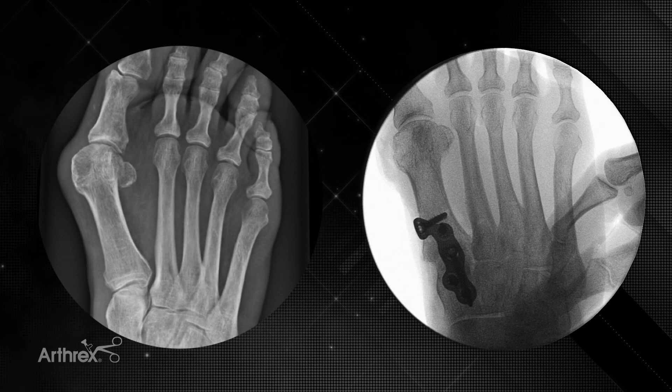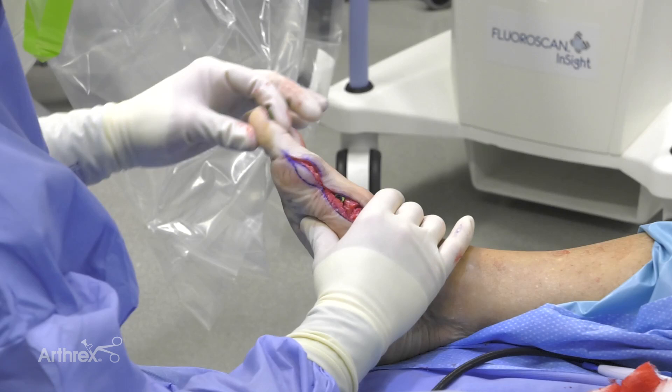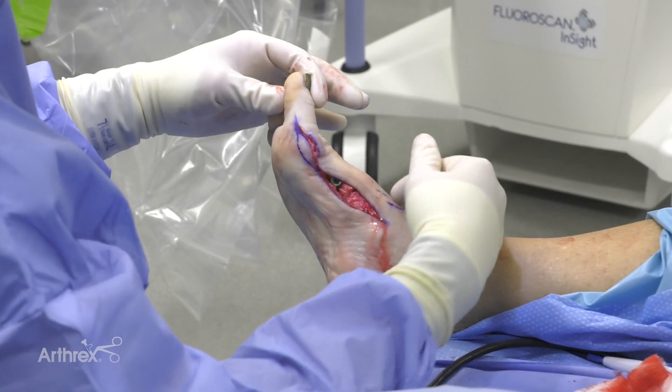So we've got a nice plantar position plate. Our sesamoids are good. I'm testing the patient's range of motion — you can see she's got great range of motion. Despite even a small amount of arthritis on the x-ray, now it's back into its anatomical position with everything being realigned — the intermetatarsal angle. Excellent dorsiflexion, probably about 60 to 70 degrees dorsiflexion, and we have plenty of plantar flexion.